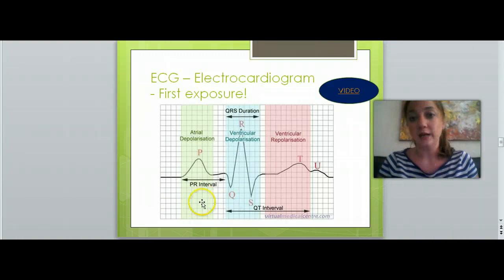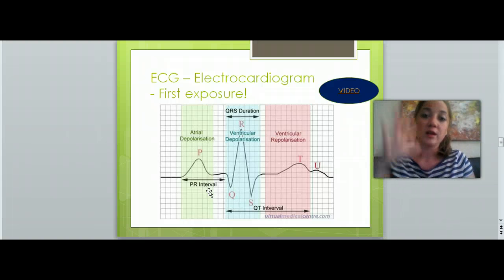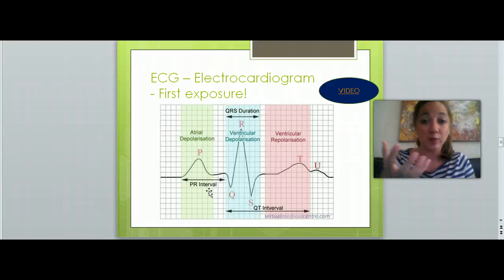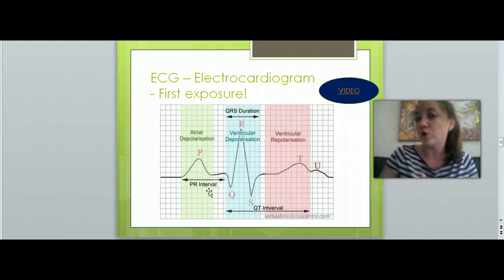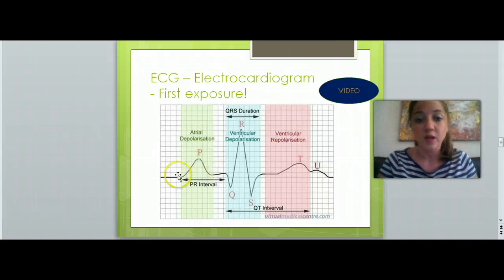So in this tiny hump, this is where we see that the atria are filling with blood and passively pushing it back through the valves into the ventricles. Okay, so that's where the atria are depolarized. They are told, hey, receive the blood, but then passively fold it down and push it into those ventricles. So what you're seeing in this P hump here is that folding of the atria, pushing it down into the ventricles. Okay, so after that happens, there's a little period of rest right here in this interval. Okay, this little flat line.